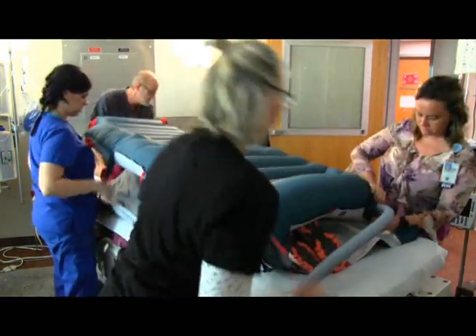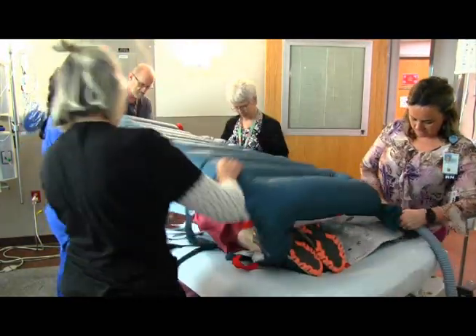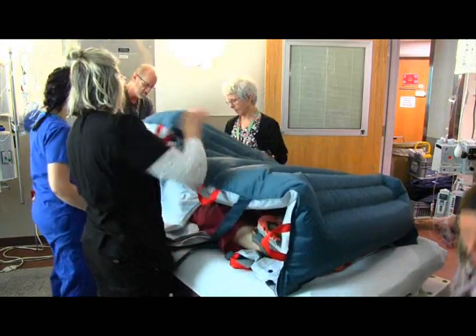Once in the prone position, the mat is deflated and removed, and the patient is positioned using the bottom mat.